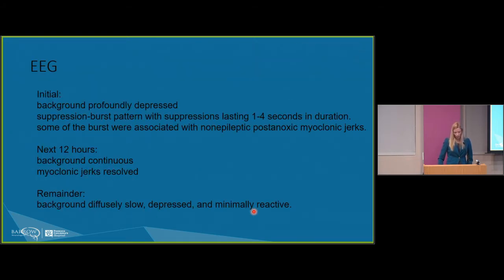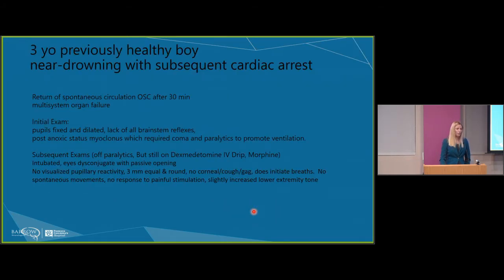Actually, I want to mention this child. As we know, all tests have a sensitivity and specificity. Resting state functional MRI sensitivity for disorders of consciousness is 0.8. So this is higher than any other test that we have right now, but is not perfect.